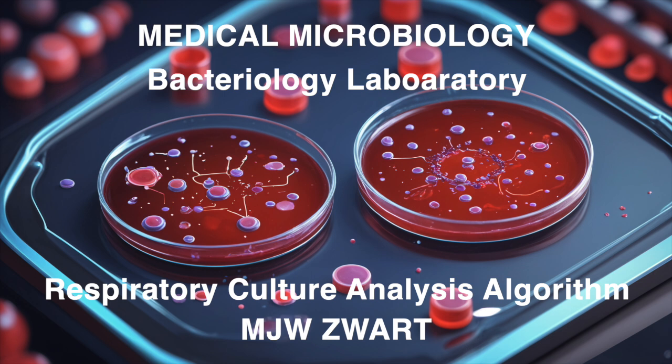So we've got the gram stain, the Q-score. What other diagnostic tools are we using for LRTIs? Well, culturing is still king, right? We've got our blood agar, chocolate agar, but sometimes we need to get more specific with our media. Oh, absolutely. The document dives into some of those trickier pathogens that need a little extra attention. What are some examples that come to mind? Well, Legionella, for one. It's notorious for causing those severe pneumonia cases, and it needs a very specific medium to grow. Yeah, Legionella is a tough one. What kind of media are we talking about? We often use buffered charcoal yeast extract agar, or BCYE agar. It's got the goodies that Legionella loves. BCYE agar. It's like a five-star hotel for Legionella.